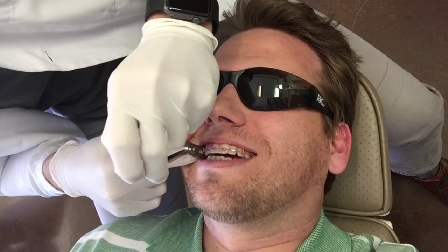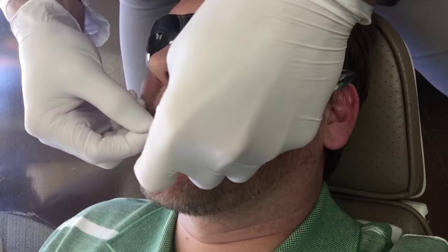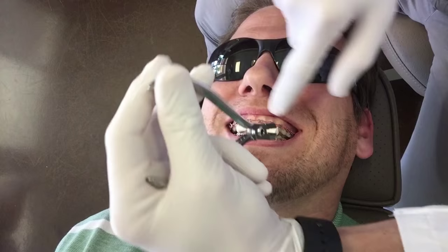Just a little bit of pressure. How do you bite down on your front teeth right here? The tighter you bite, the less pressure you feel. So first I'm going to take off all the brackets, and then there'll still be glue on your teeth, and then I'll go through and polish off all the glue.